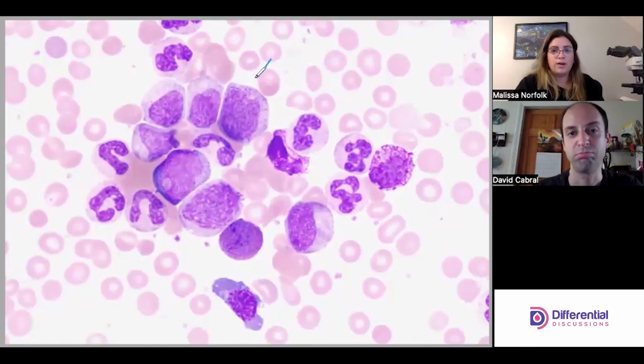Okay, we got a couple more. We do. Kind of feeling myelocyte on this fella. Yep. I like that. And for this fella, I think so too. Yeah.